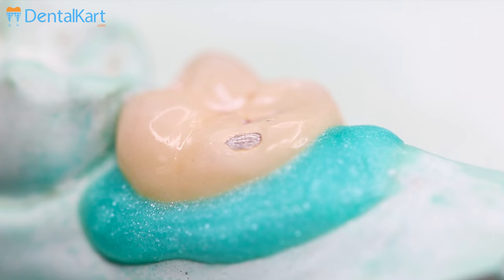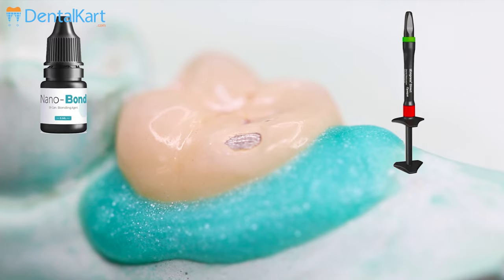After etching and priming, the crown surface is ready for applying bond adhesive, opaque if required, followed by composite restoration.